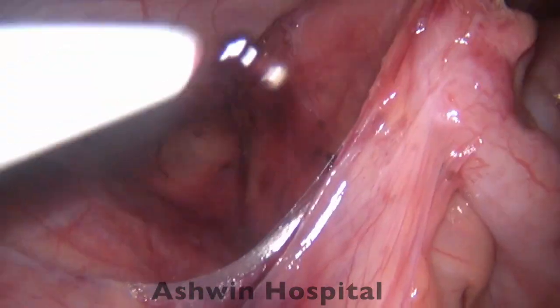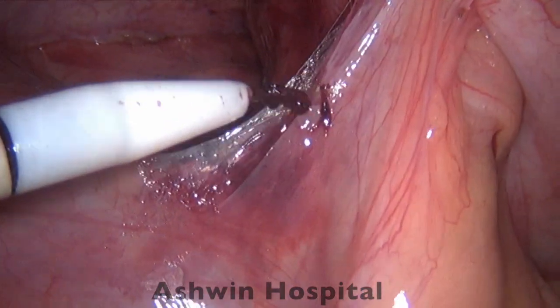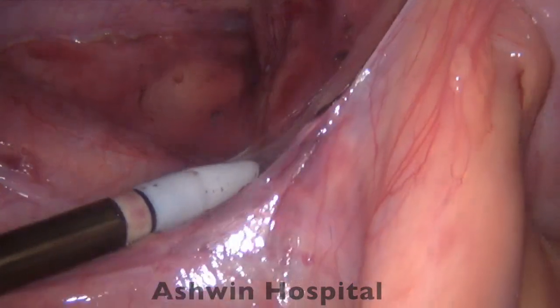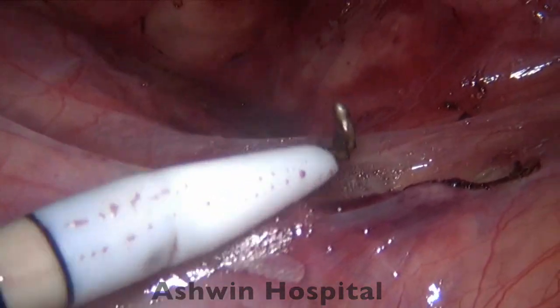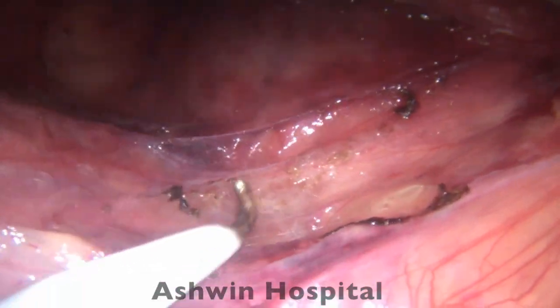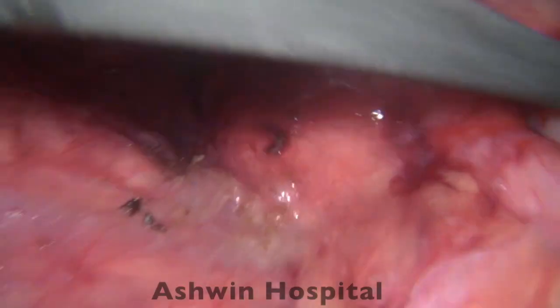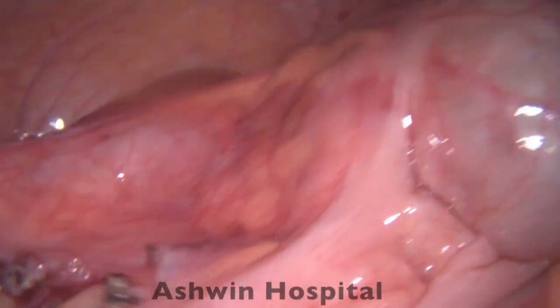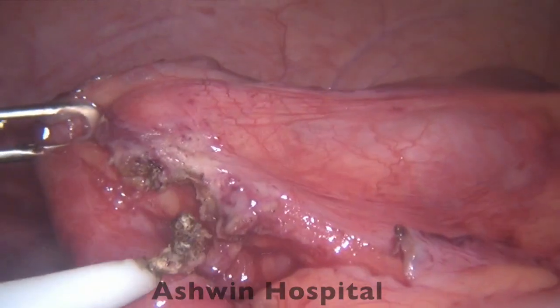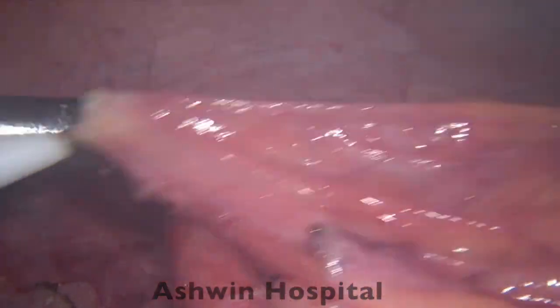We now need to identify the exact location to incise, being wary of the small bowel — namely the terminal ileum — which joins the cecum near the ileocecal junction. Once the exact location is identified, dissection becomes much easier. We do a little more dissection so we can rotate the cecum and appendix clearly away from retroperitoneal structures. The appendix and meso-appendix must be fully exposed before appendectomy can be performed comfortably.